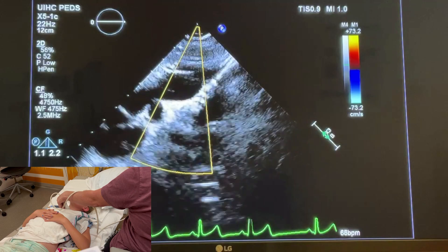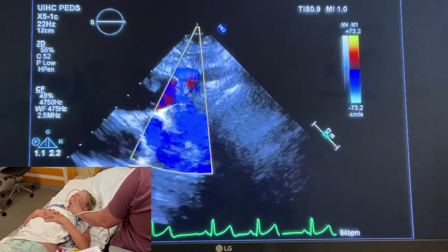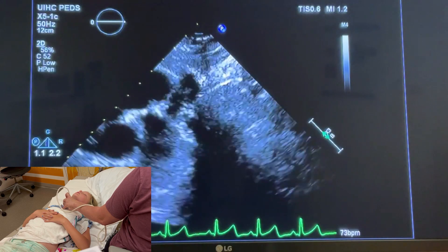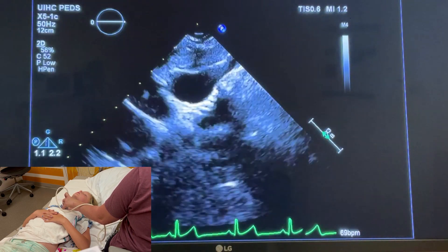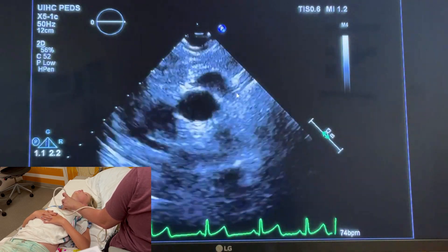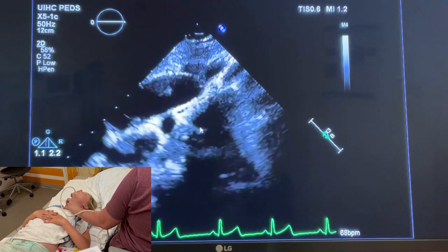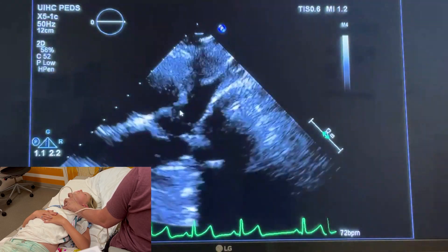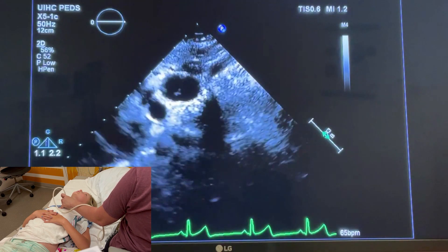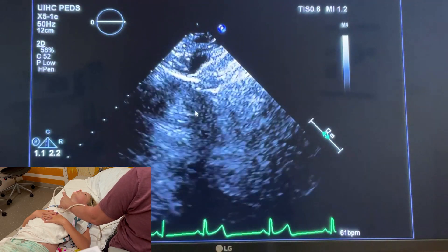Now rock the tail towards the right shoulder and the footprint over to the left shoulder — we're going to do a tracheal sweep. Here is the SVC, and slowly there's the ascending aorta. Tip up — here are the tracheal rings, the striated lines. You want to see those before the descending aorta. This proves that it is a left arch: RSVC, ascending aorta, tracheal rings, descending aorta.